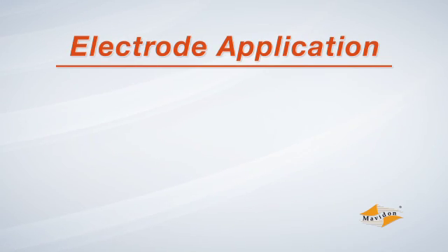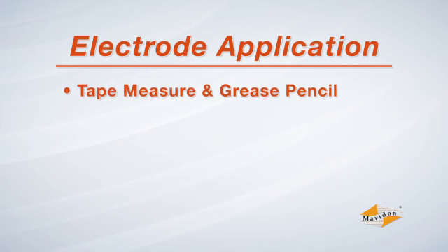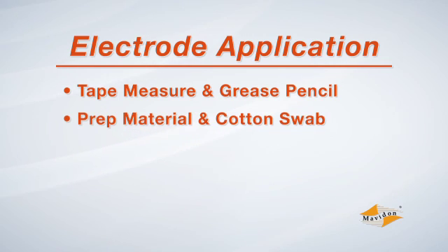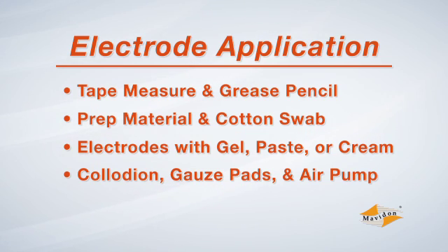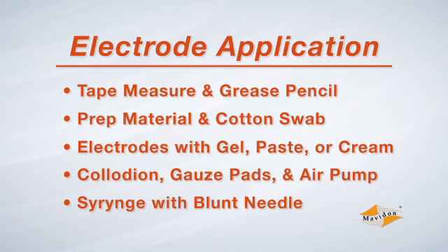Electrode application using collodion requires the following items: a tape measure and grease pencil for measuring and marking the head; prep material and cotton swabs or gauze pads for cleaning the electrode site; electrodes and electrode gel, cream, or paste; collodion; gauze pads; and an air pump. Also needed is a syringe with a blunt needle to inject the electrode gel.